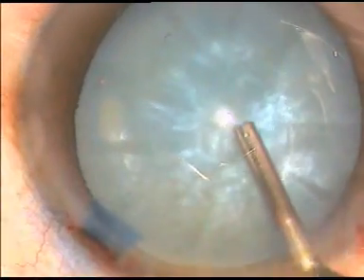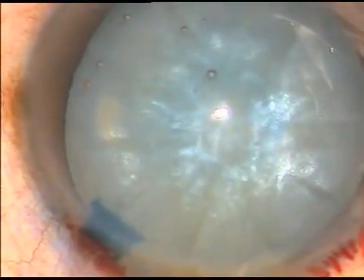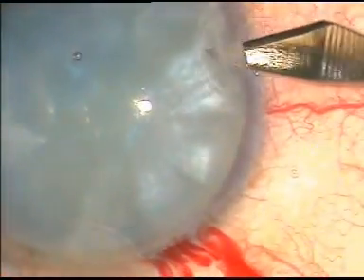Viscoelastic substance is again injected into the anterior chamber. Now another side port is made at around 8:30 o'clock.